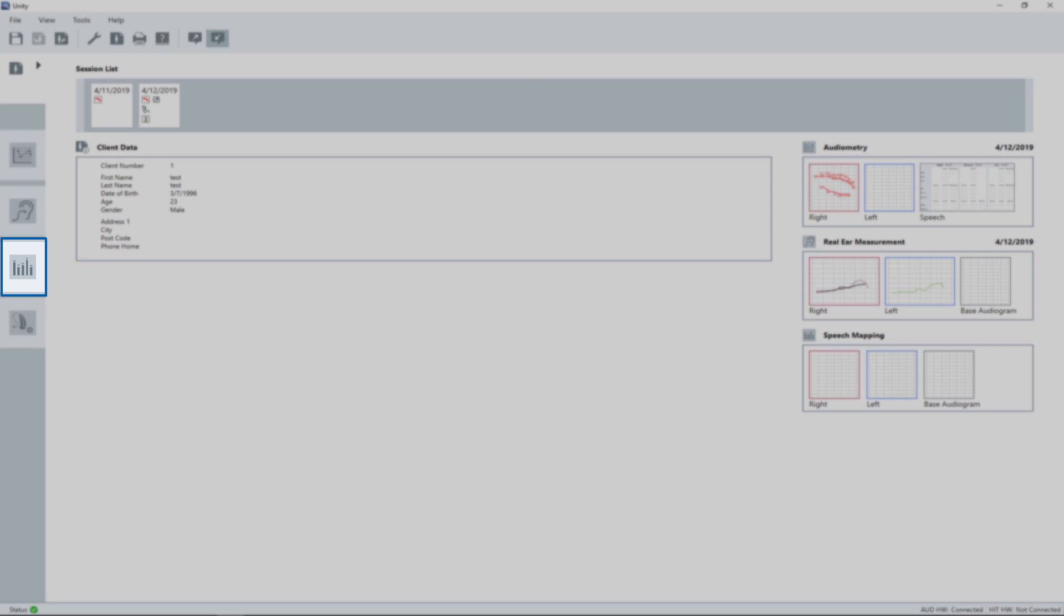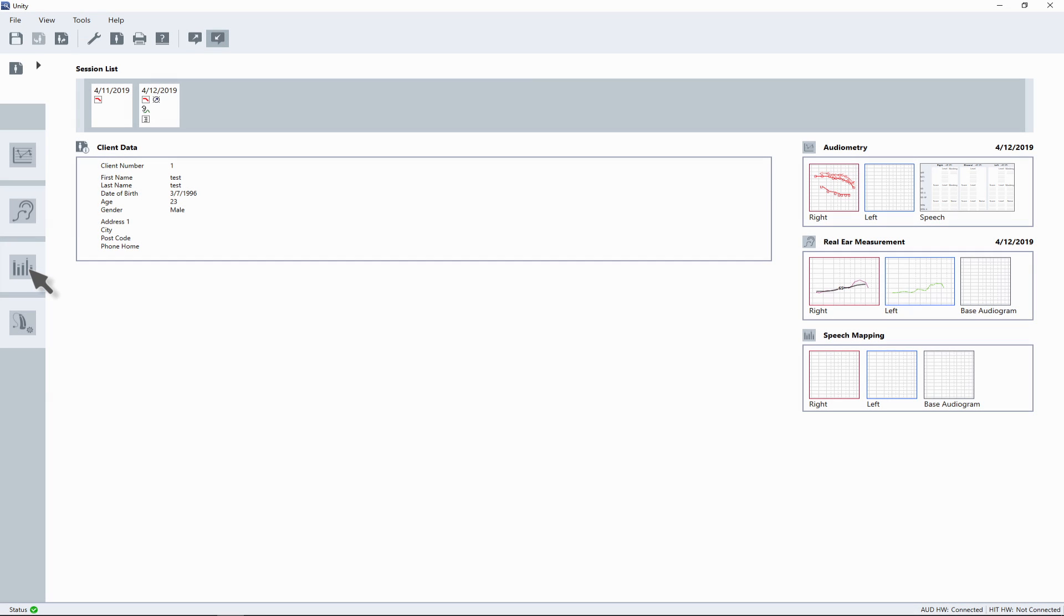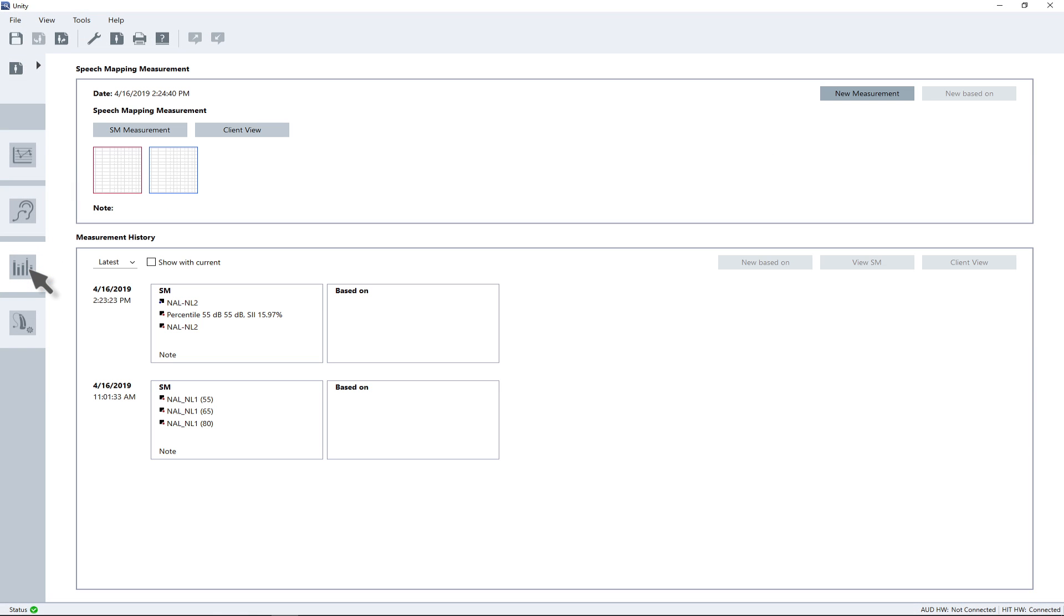To access the percentile analysis, navigate to the speech mapping main page by clicking on the speech mapping icon on the left side of the screen.